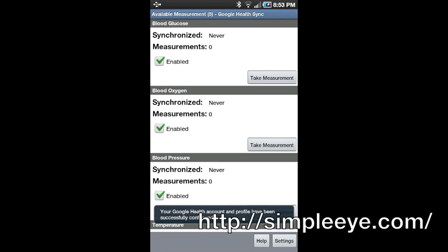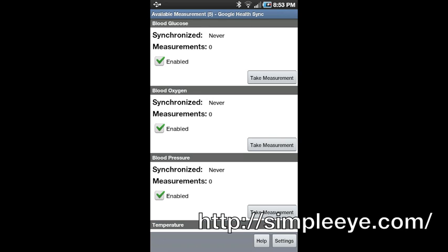Once Simple Eye Google Health Sync is configured, a list of the supported measurements will be shown. You can tap the Take Measurement button next to the type of measurement you wish to take. We will use a Bluetooth pulse oximeter to take a blood oxygen measurement.